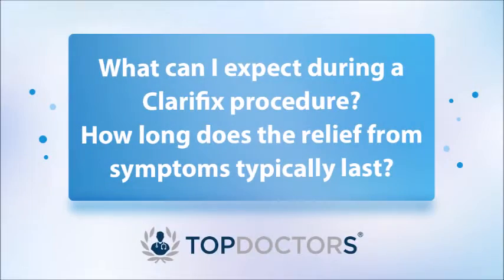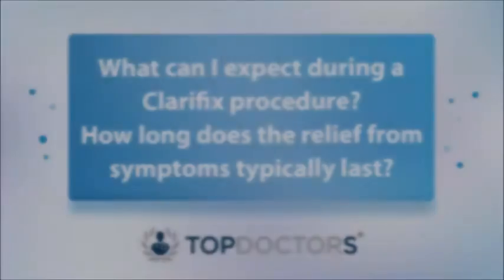The Clarifix procedure is done almost always under local anesthetic. It's very well tolerated and only takes about 20 minutes to do. The way I do it is I bring the patient into my outpatient room.